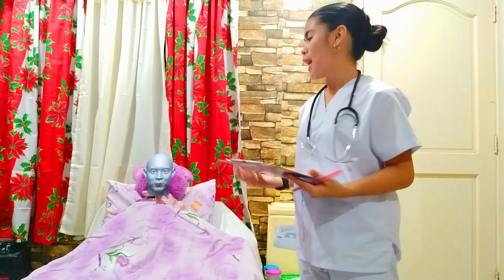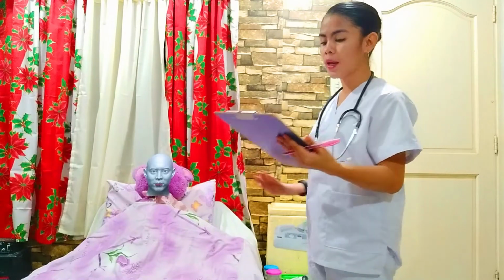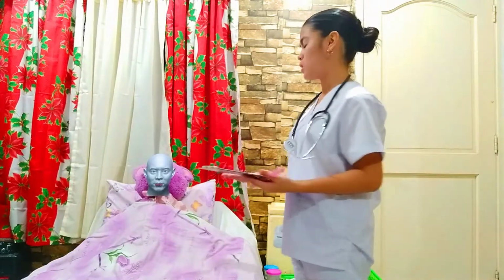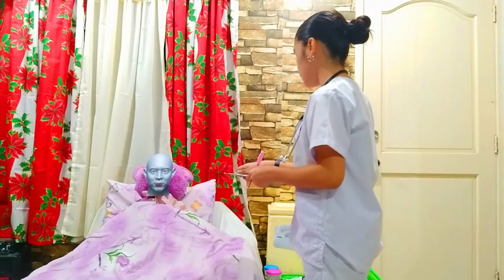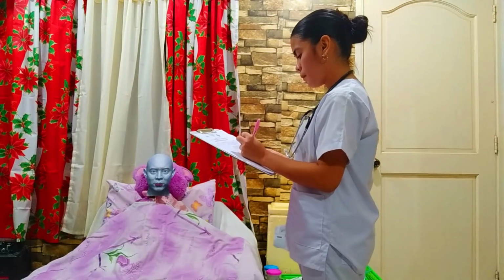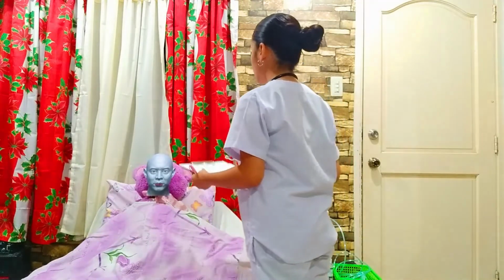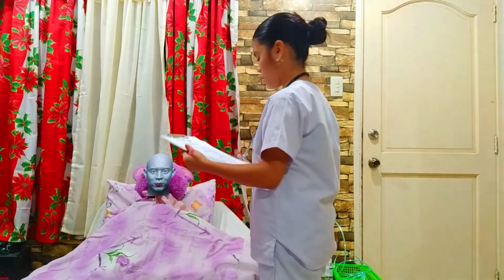And as a student nurse, we should have therapeutic communication skills, which will be used to apply appropriate listening and questioning skills with the client. So, sir, are you comfortable po with the implementation of the procedure? Okay. And if you're not comfortable po, you are free to say what you feel and what you need all throughout the procedure po.